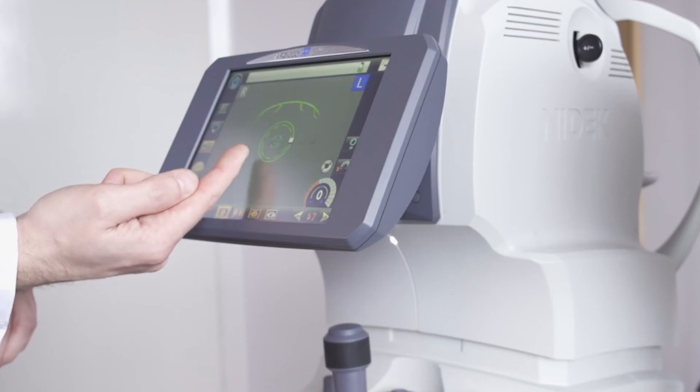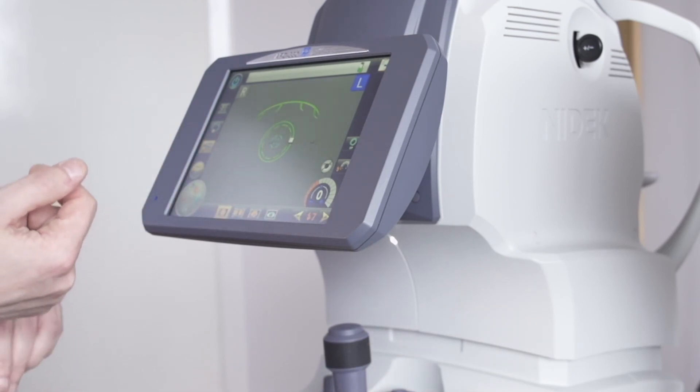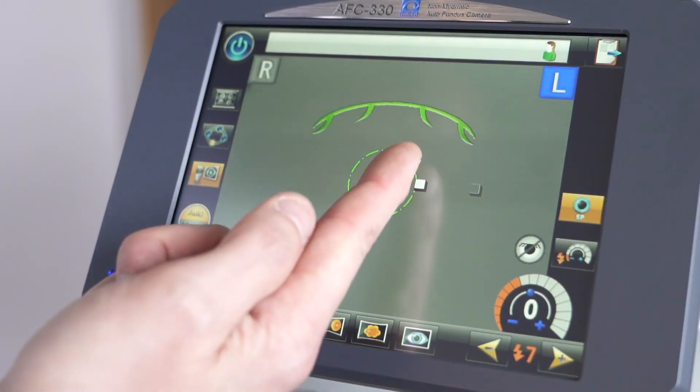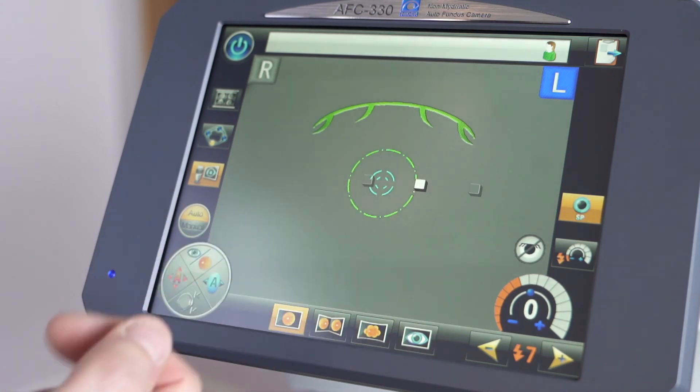Ideally, the outer circle which equates to 4mm pupil size should be your minimum pupil size. If we press the small pupil mode, we go down to a smaller pupil size of 3.3mm to allow us to take photos with a smaller pupil.